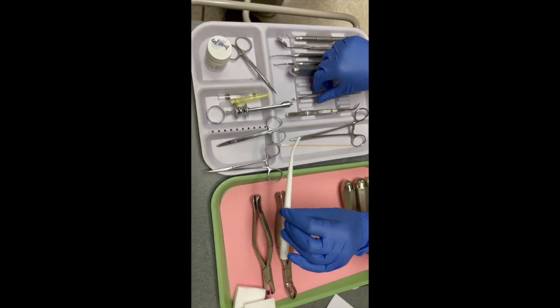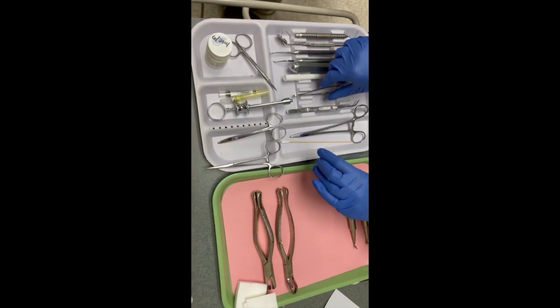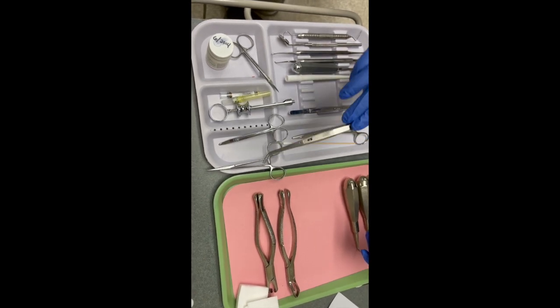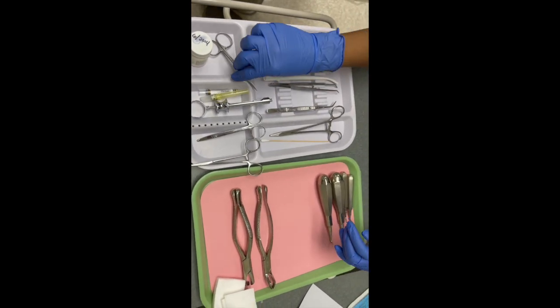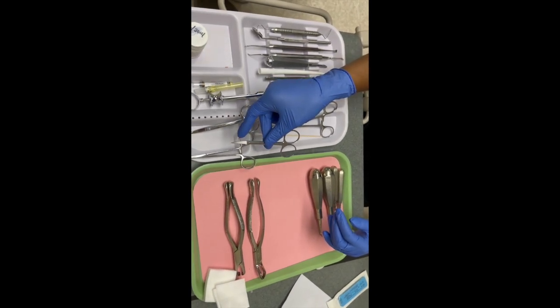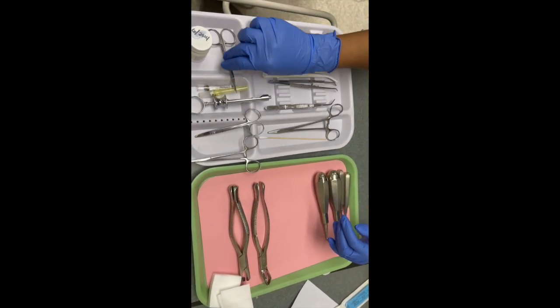Then you have your high suction HVE. You have your cotton forceps for indirect retrieval. And you have your scissors just to cut anything like tissue or anything that needs to be cut during the procedure.